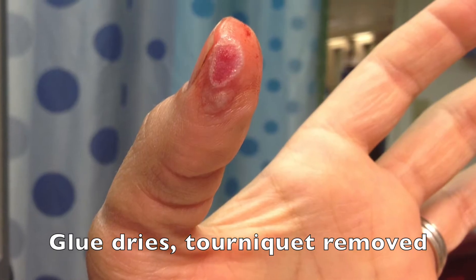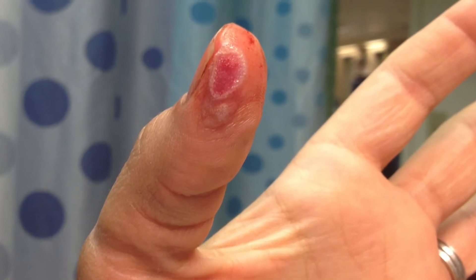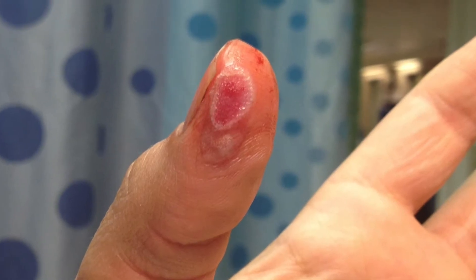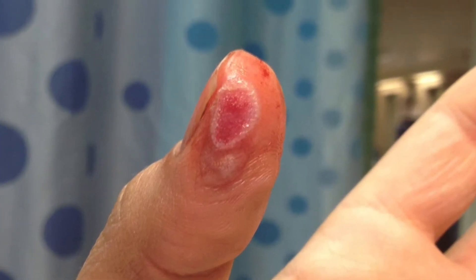Once that glue is completely dried, and only once it's completely dried, you'll go ahead and remove the tourniquet. What you end up with is this scab-like wound over the avulsion with no further active bleeding.